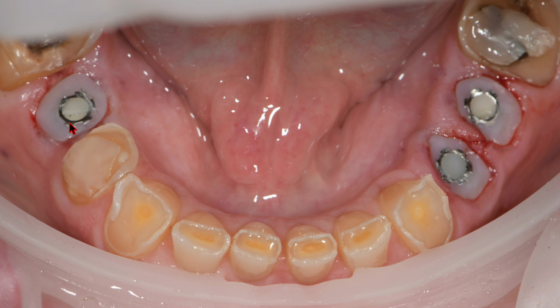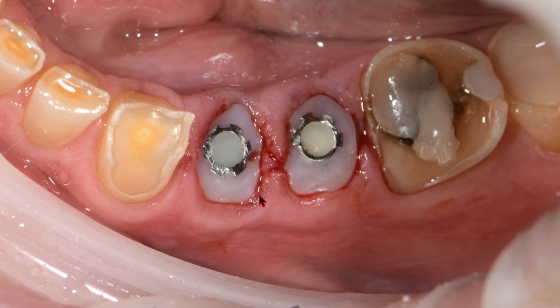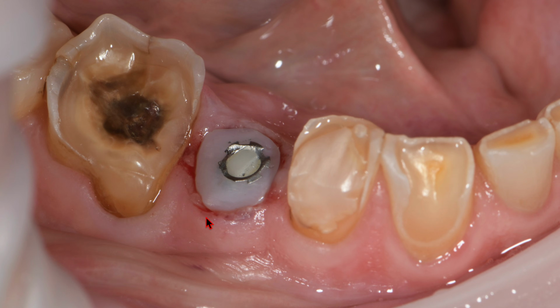I did all 3 at once, as well as the custom healing abutments. Probably took me longer to make the custom healing abutments than it did to actually place the implants. That's just the way it is. These are kind of time consuming, but they give me the maintenance of the outline form of the previous tooth. So you can see here, nice support for the outline form. I think that this is a critical step if you're doing immediate implants to get the best result. You can see here, nicely supported.